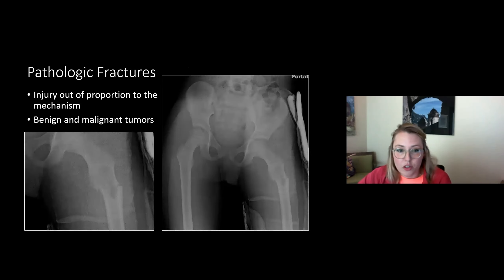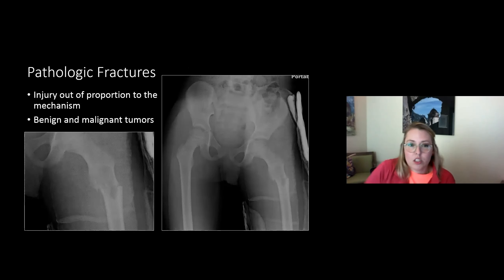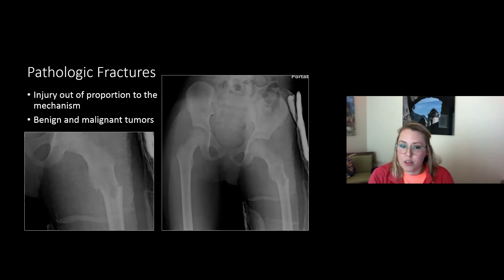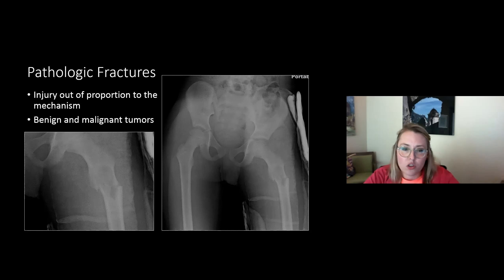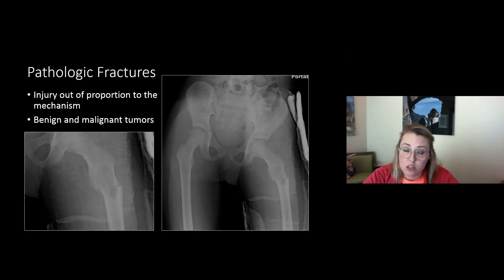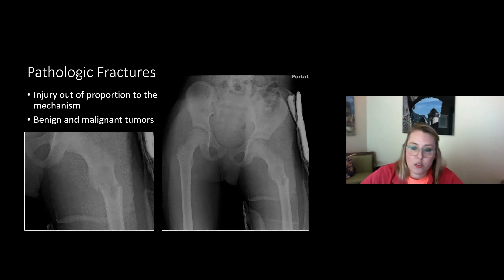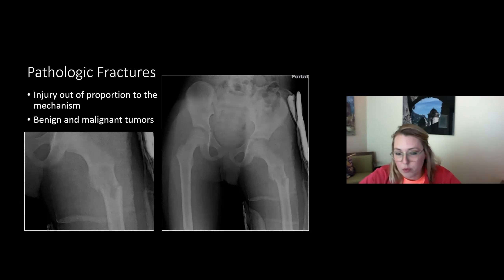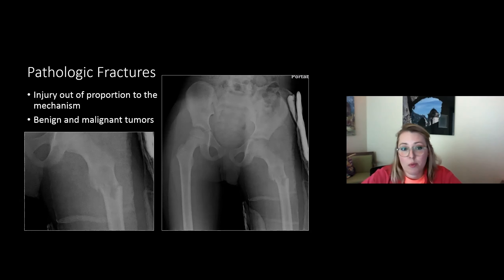Children don't typically break their femurs playing Little League or on the playground. If you have an injury seemingly out of proportion to the mechanism, closely scrutinize the bone for an underlying lesion. In the lower extremities of kids, it's usually a benign lesion — some kind of bone cyst or non-ossifying fibroma that has weakened the bone — but malignancy is possible. Not everything that presents as trauma is trauma, and not everything that presents as trauma is only trauma.